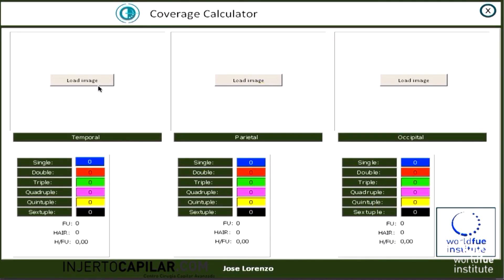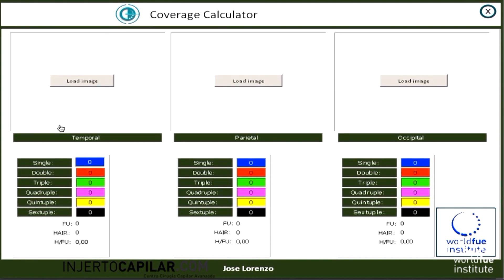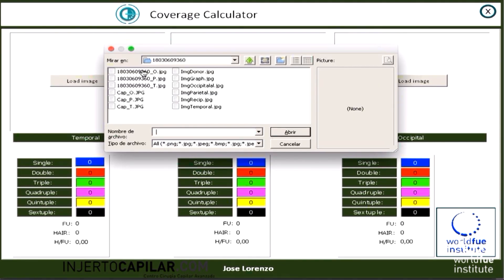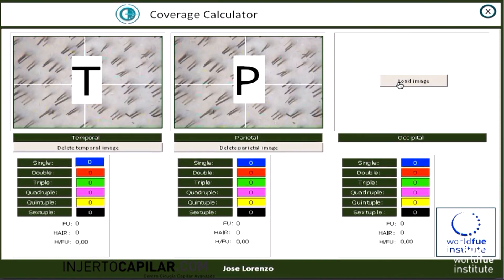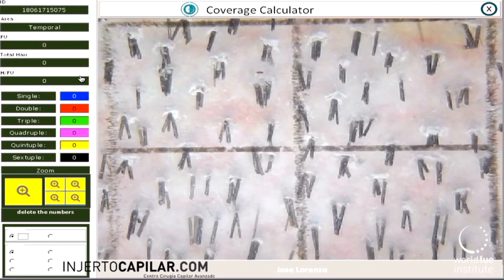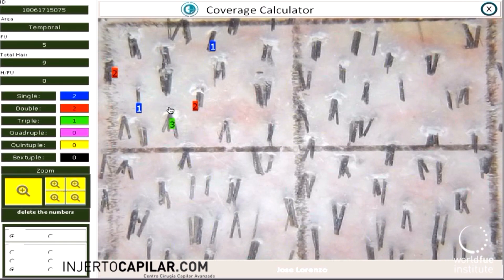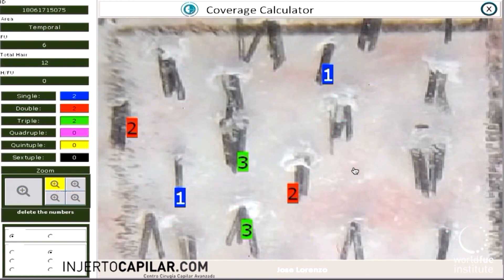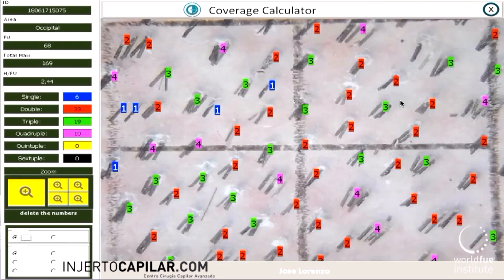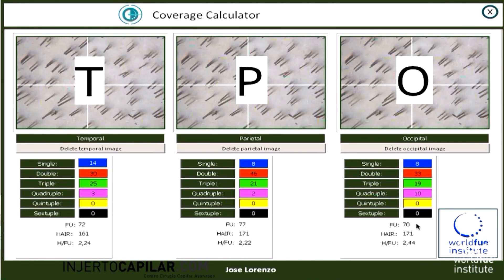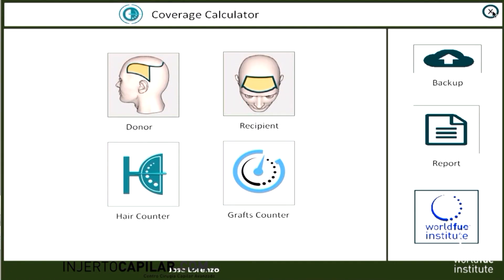We go to the hair counter tab. Prior to opening the image, you need to upload the photograph taken with the dermal light in the different donor areas — here is the temporal, then the parietal, and last the occipital. When we click on the letter, we open the hair counter where we can count the hairs: singles, twos, threes, fours, and so on. You can use the magnifying window to enlarge the area and facilitate the count. If you make a mistake, you can delete by clicking here and adjust again by changing the button. When we finish counting the whole area, we go out and see the number of follicular units and hairs per square centimeter and the hairs per follicular unit.